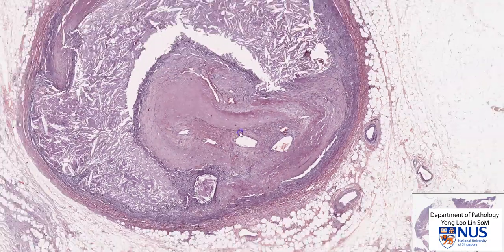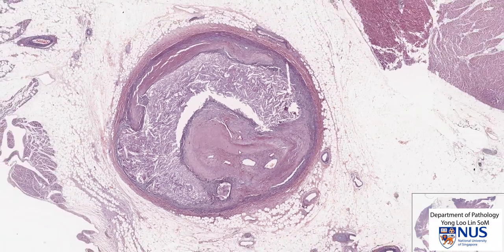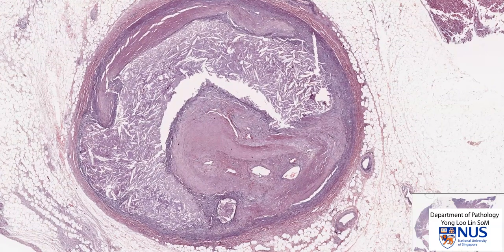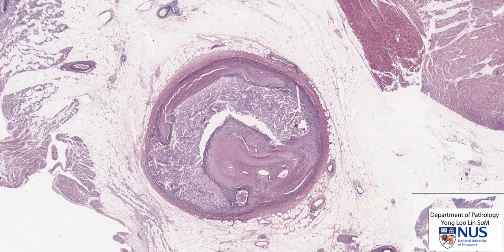This patient had survived the initial myocardial infarction with the occlusion of the coronary artery, and now this is part of the healing process — organization of the thrombus — where there is a lot of collagen being laid down and a little bit of recanalization in order to re-establish some blood flow. This is an example of an organized thrombus with an underlying atheromatous plaque.